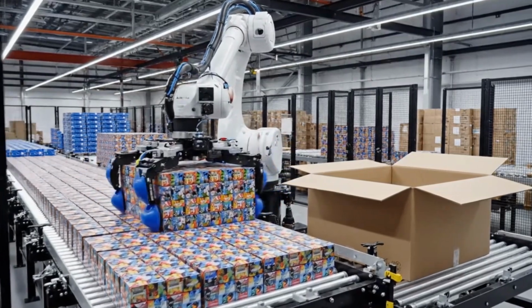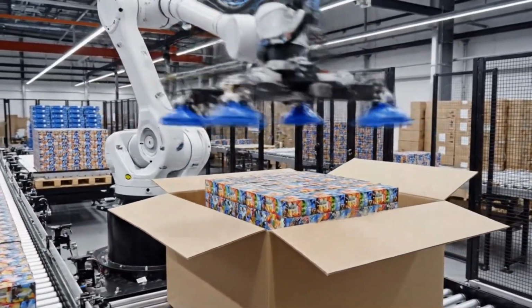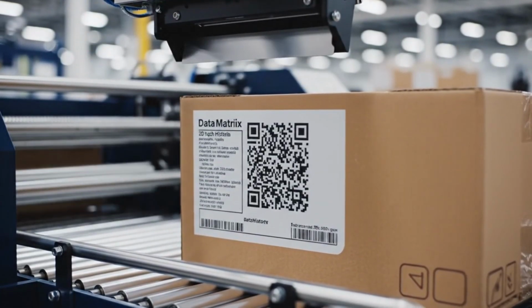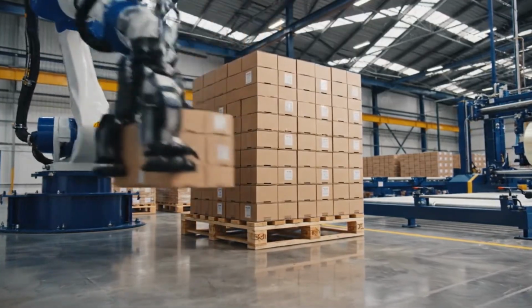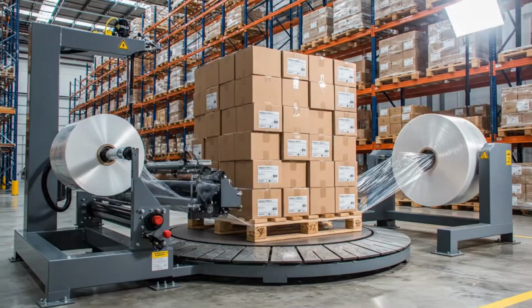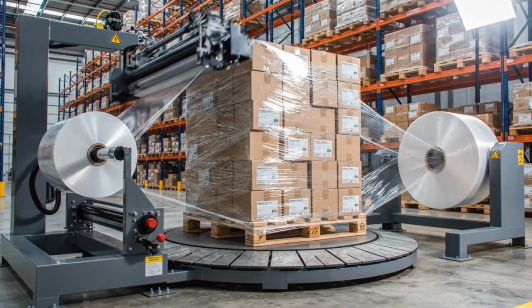From individual units to bulk cases, the automation ensures zero damage during handling. Digital transparency allows us to track this specific case to any pharmacy or warehouse in the world. Efficiency in stacking reduces the carbon footprint during transport. This protective layer ensures the boxes don't shift or get damaged during sea or air freight.